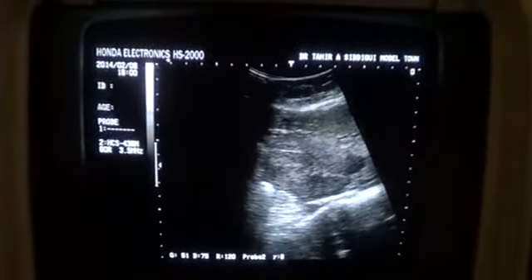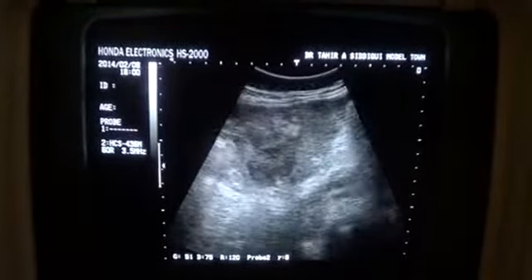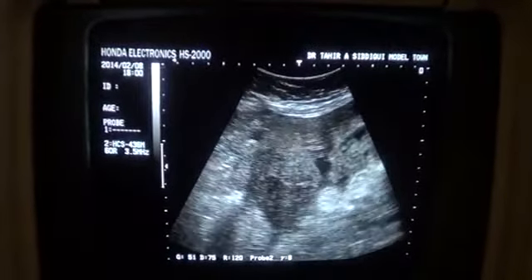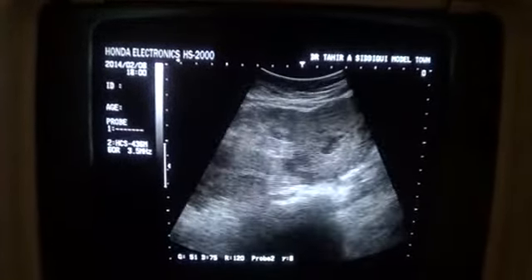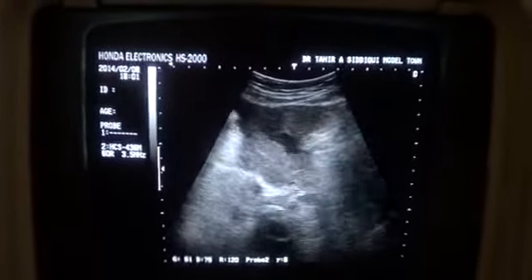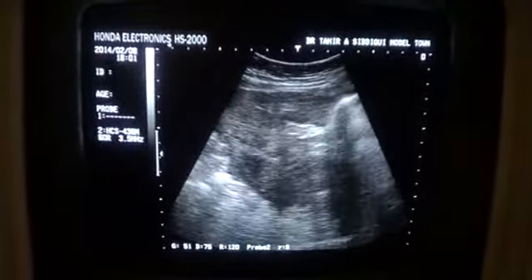Echogenicity is mixed, and it travels from the midline, expands on both sides of the midline with fluid around, and this finding is consistent with either bleed or some aggressive pathology, having irregular outer margins. I am showing you from all the possible segments.